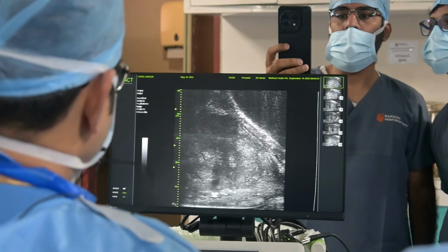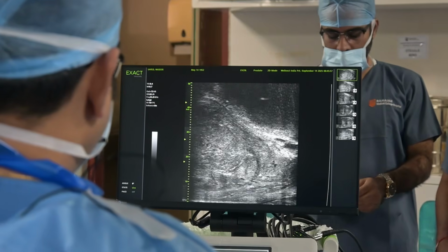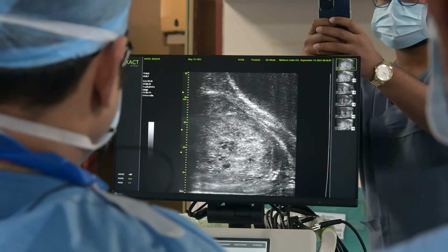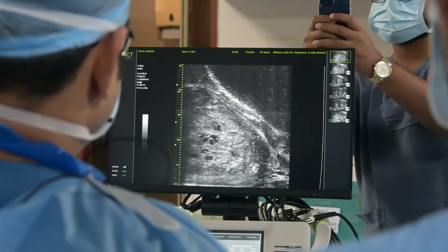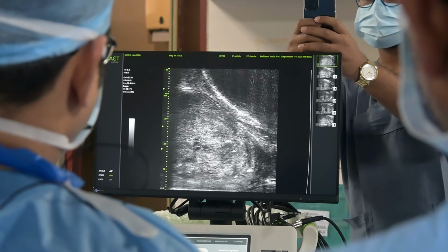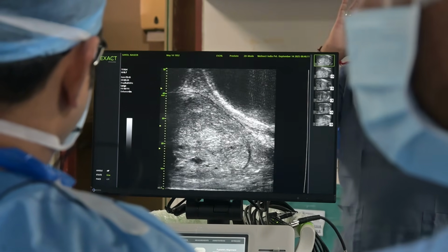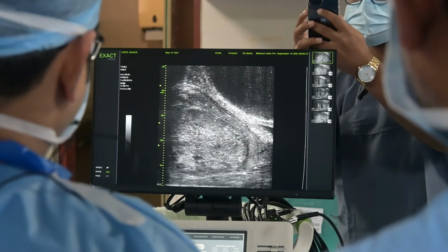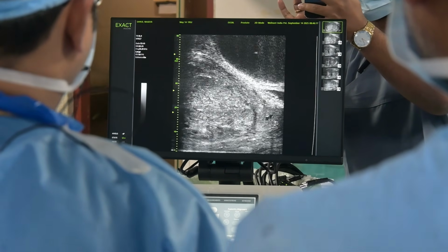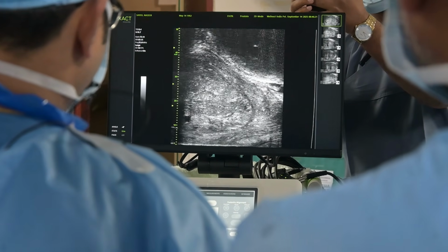Okay, sir. So first I will take a few targeted biopsies, from the starry sky that we are seeing there, and that will be a target, and from a few nodules that I see as PRIMUS 3. In my mind, this is a benign gland, but we will see. Okay, sir. So I will increase the depth to 30 now for a biopsy. Please put the biopsy mode on.